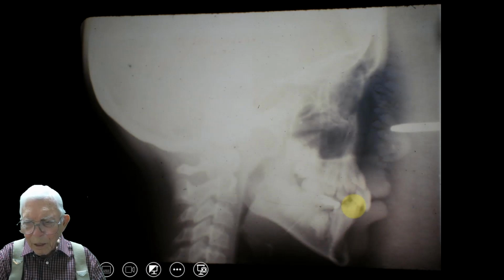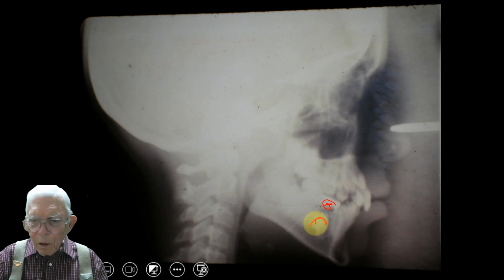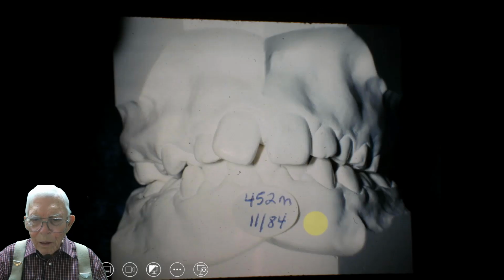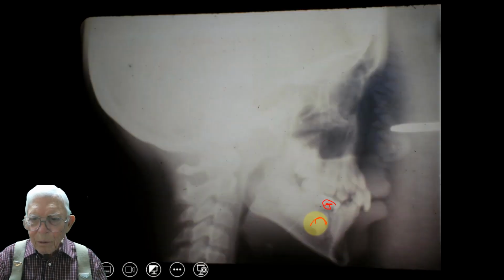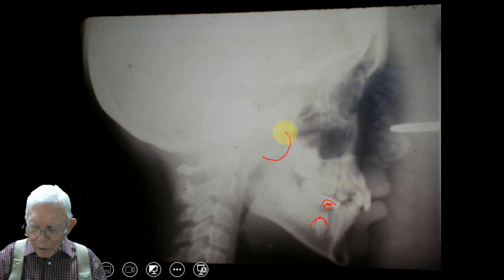Now here's this case where this deciduous tooth right here was crowned and treated, and there's a delayed eruption of this bicuspid. You won't see it really good until you get into the panorex in just a few minutes. So, all right, we'll go ahead here. Let me go back here and see. Now at this point, we don't get a good view of the adenoid tissue coming in here, but it's a pretty good size right in there, and I have another shot later on, and you can see it much better.